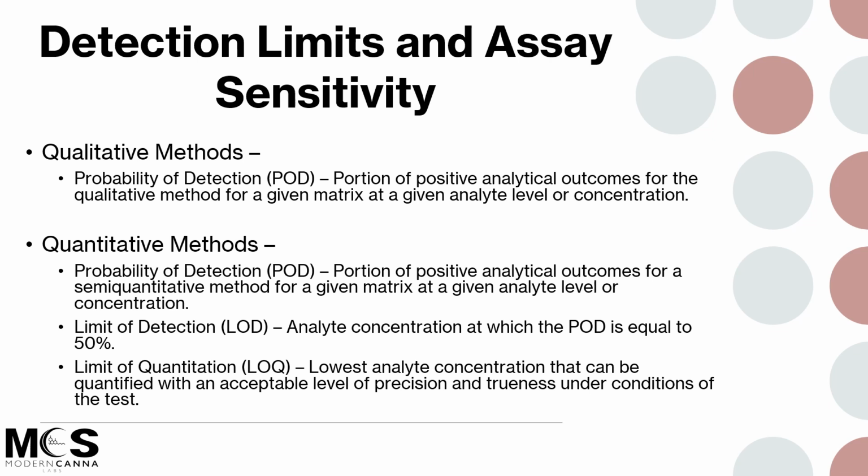And so for these two factors, I want to go ahead and break the method development out into two separate categories, being the qualitative and the quantitative. So for qualitative methods, we're looking at methods that just say, can I see this analyte? You don't have to say an exact concentration, just is it there?